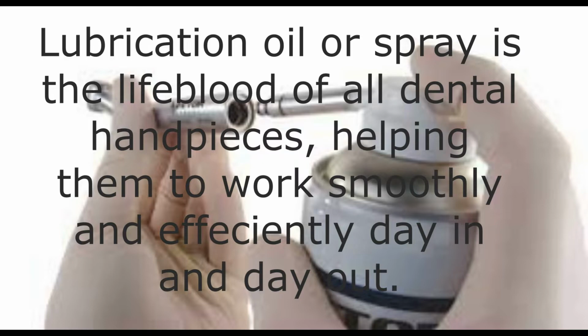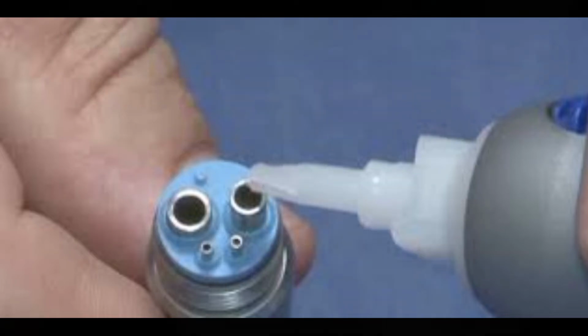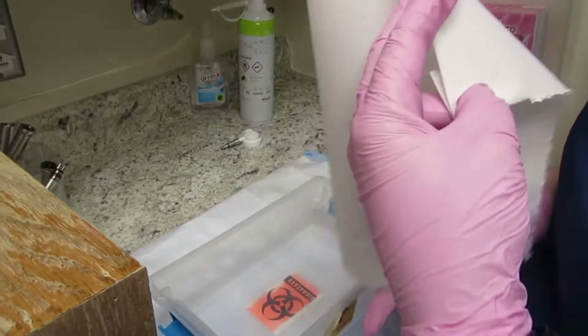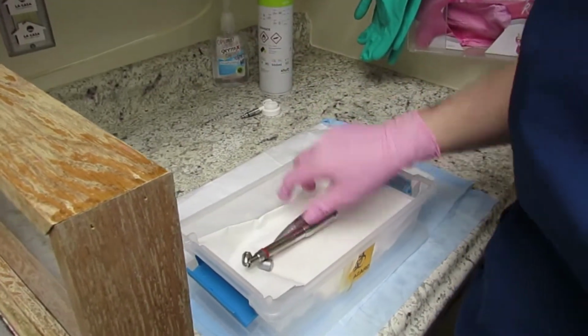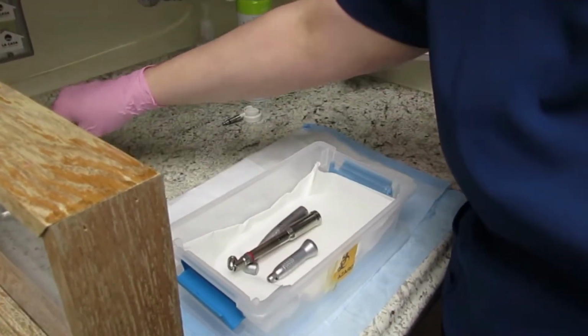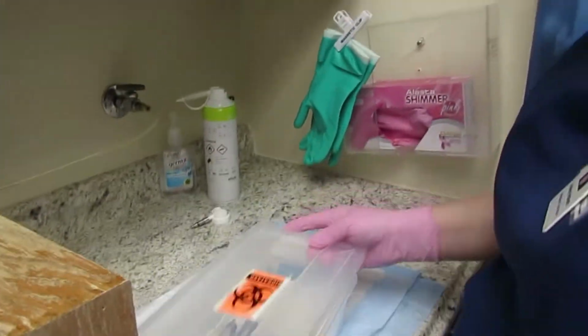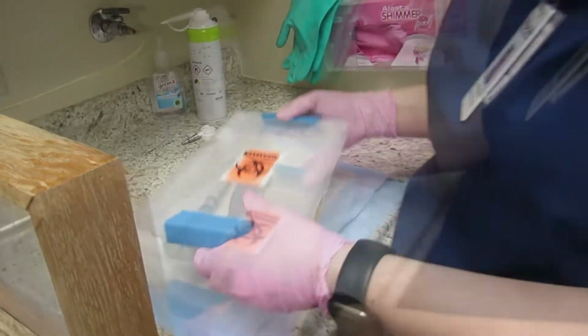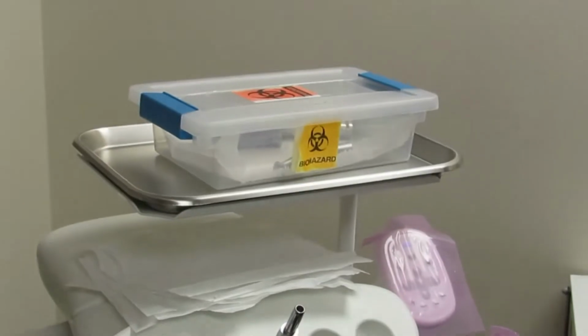Lubrication oil or spray is the lifeblood of all dental handpieces, helping them to work smoothly and efficiently day in and day out. After holding the handpieces for 2 hours, they will be placed in a small lockable container ready to be transferred to an operatory room. Instruments are to be transported in a lockable container at all times.